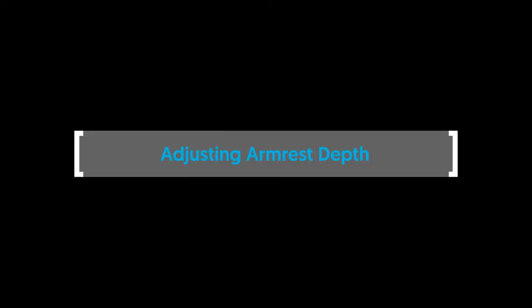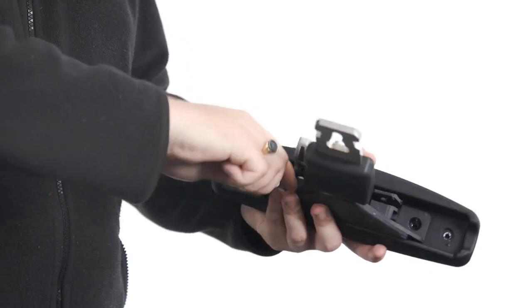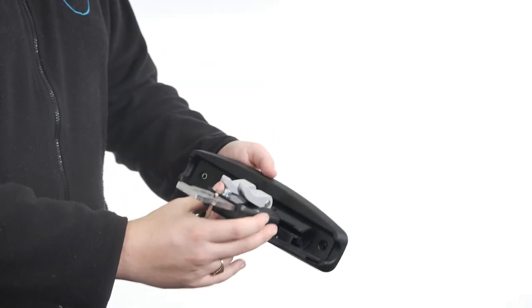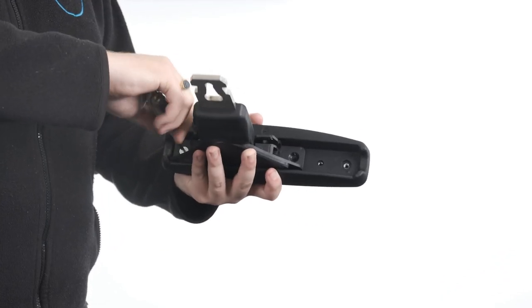Adjusting armrest depth. To adjust the armrest depth, remove the bolts to separate the PU pad from the platework. Reposition the pad in one of the three positions and insert the bolts. Tighten the bolts to secure in place.